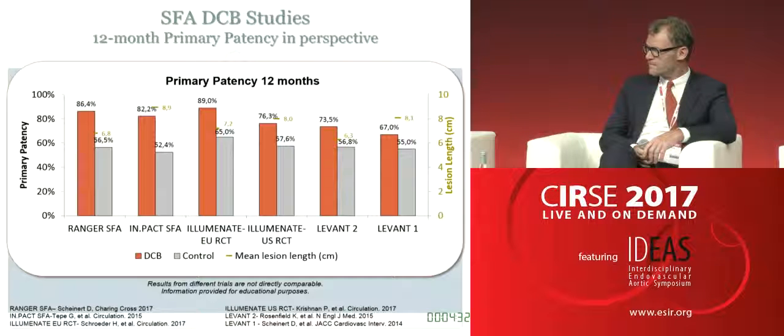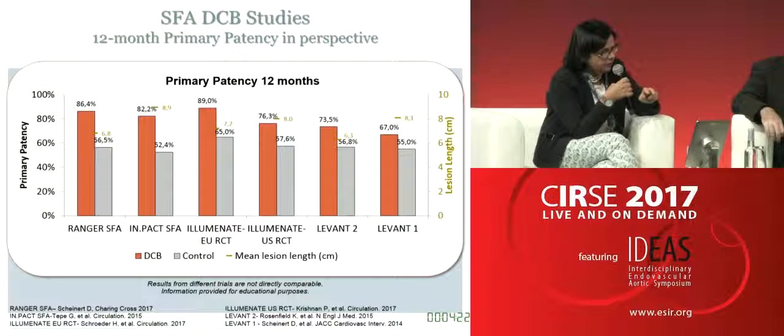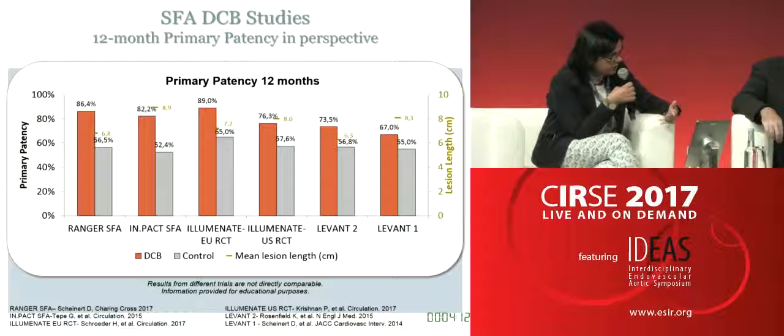And what we have at this time, we have randomized controlled trials where we show efficacy. I agree with you that cost effectiveness is a very important point. But anyway, I think we also have data on that point that if a patient with PAD is not coming back to be treated once again, because besides cost effectiveness, we also have to take into consideration how the patient is looking and how the patient is presenting, and PAD patients are usually not the healthiest ones.